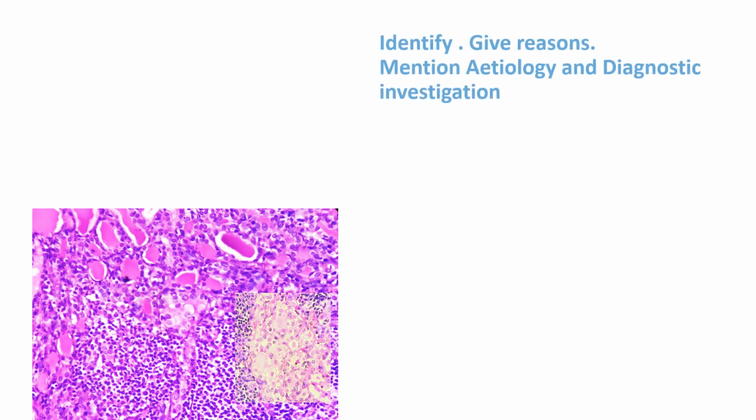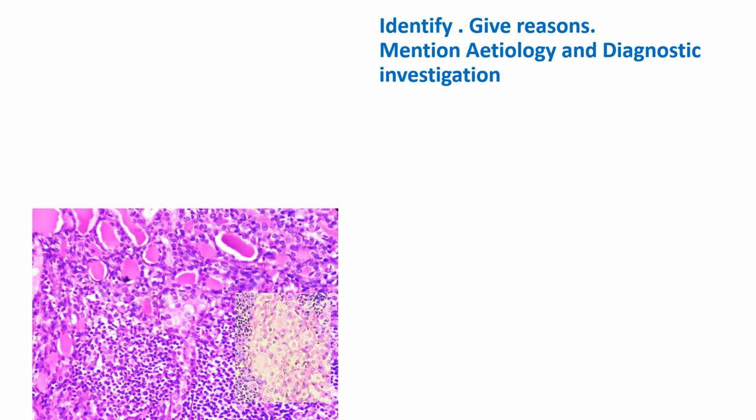Okay, this is the lesion with high power. Now identify and give reasons. Mention the etiology and diagnostic investigations for this condition.